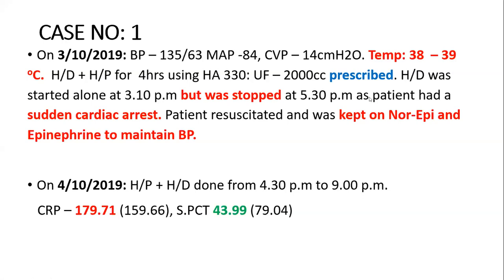Okay. So the patient was resuscitated and was on double inotropes. As we could not do the hemoperfusion on the third, we did it on the fourth. And at that time the PCT was going down.